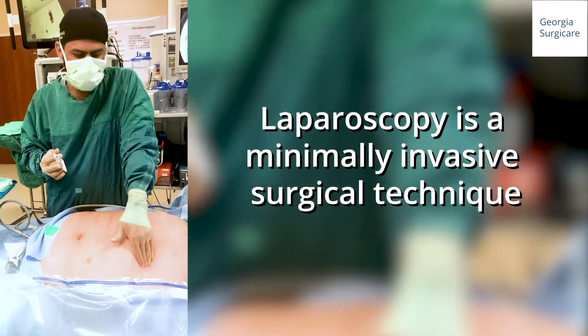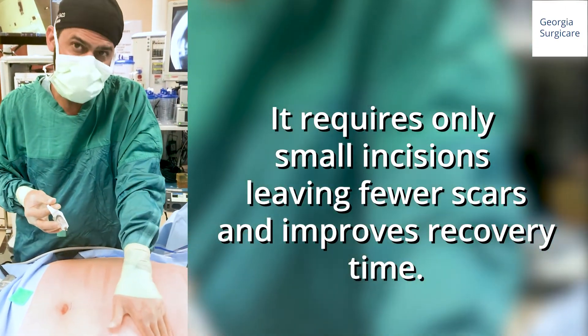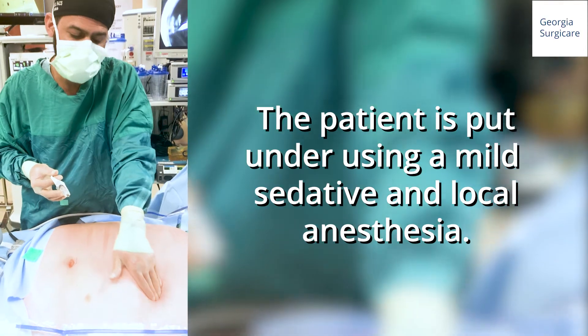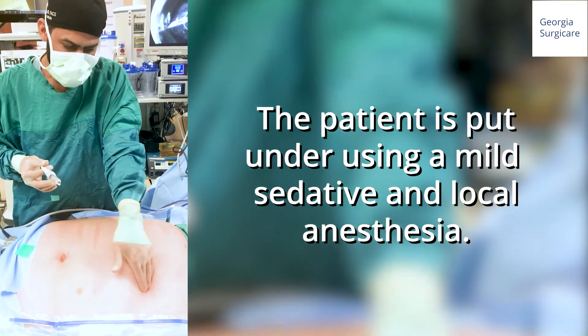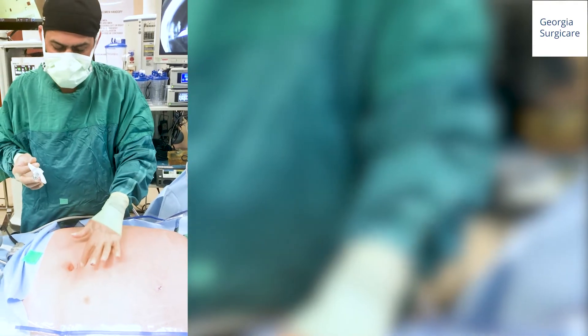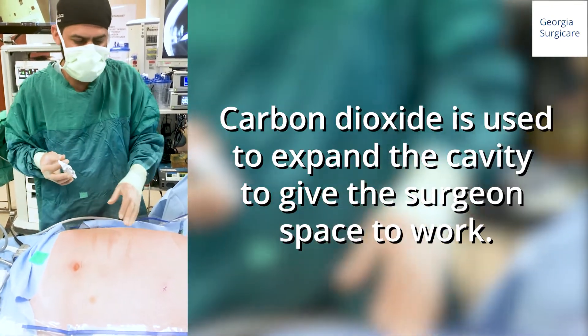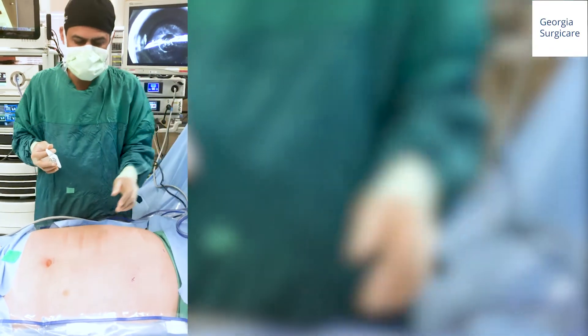One thing I forgot to mention in the previous videos: if you're putting a port in the left upper quadrant, make sure there's an OG tube or NG tube to decompress the stomach. If you're going peri-umbilically, make sure there's a bladder catheter. I usually don't put catheters, but we do put the OG tube, which is in place.